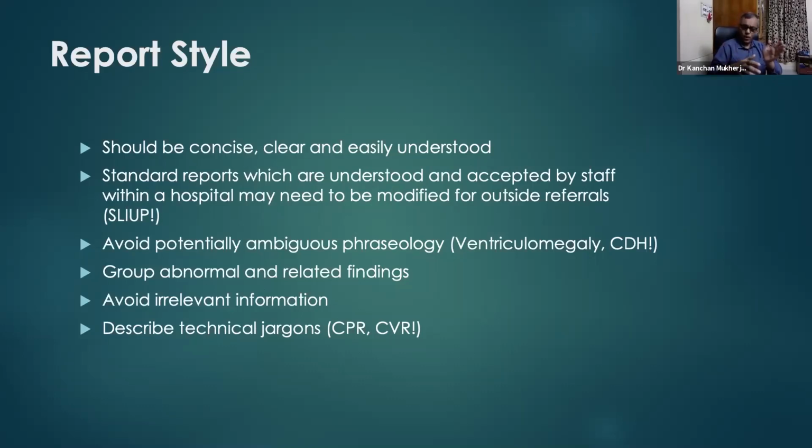And then maybe you group another set of findings which are related to each other. Okay. Avoid irrelevant information. And you will know that differs case by case. And technical jargon. Again, if you say CPR to an obstetrician who hasn't been updated in the last 5 years, they may say, what is CPR? That's cardiopulmonary resuscitation. But until and unless you say it is cerebroplacental ratio, it may not be clear. Similarly, CVR, that's CPAM volume ratio. You cannot expect your obstetricians to know that.